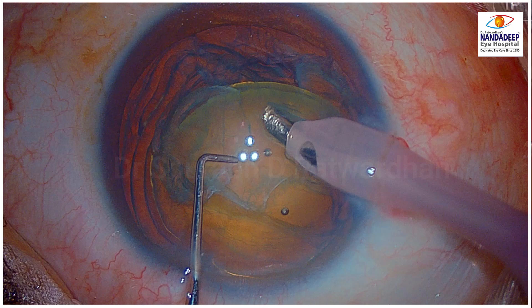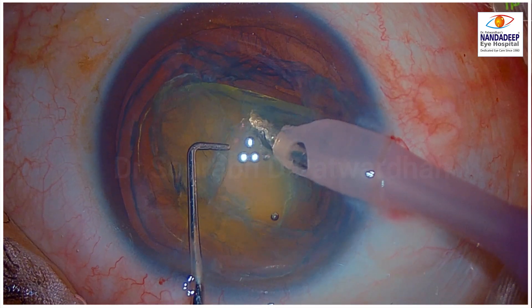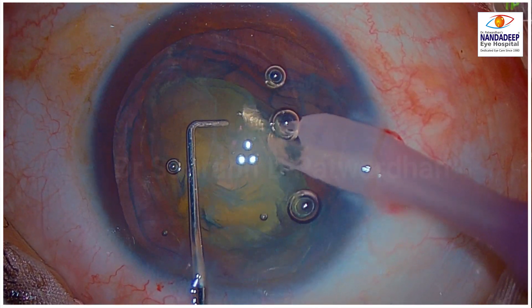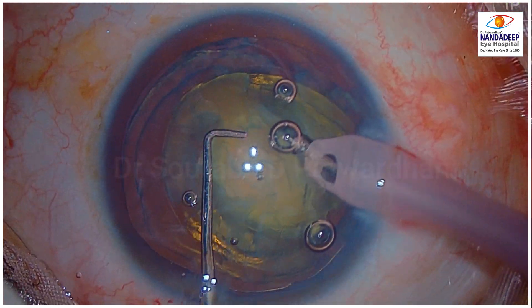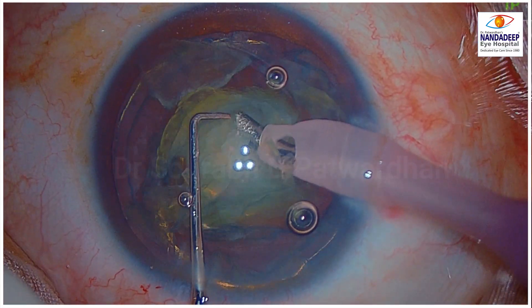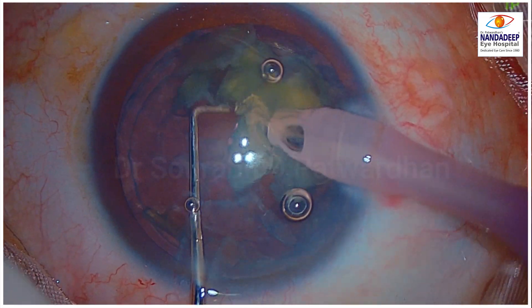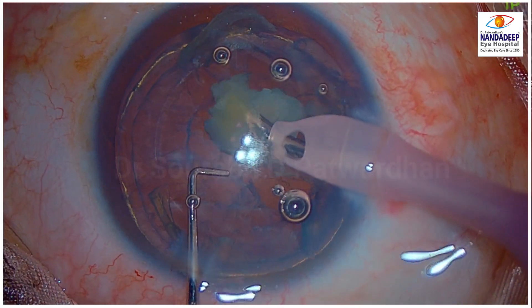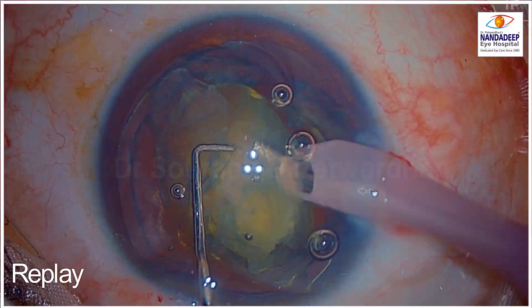The most important thing is the application of the FACO power. You can see I am applying it at the periphery of the nucleus, which is most important. Because if you go into the central part of the nucleus, you have to chop the nucleus, and that is something I don't want. So I am just going to apply this FACO energy at the anterior pole and at the periphery. Once I start removing this peripheral part, the nucleus becomes smaller and smaller and I can easily emulsify it using high vacuum. When we use very high vacuum, the requirement of FACO energy is also minimal, and we can finish off this nucleus.